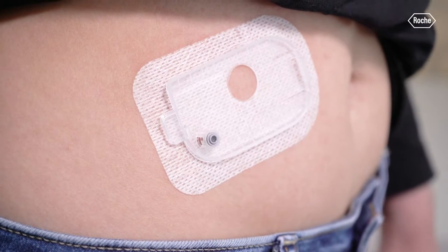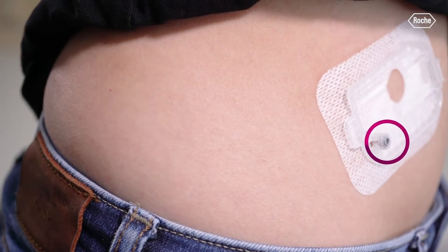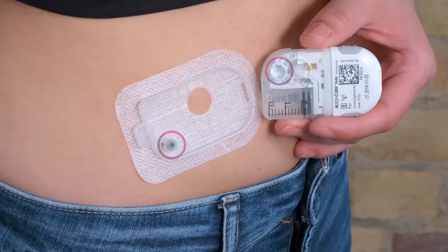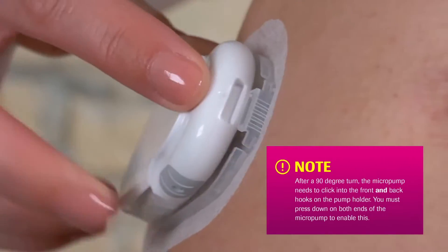The underlay pad, placed down using that applicator, lasts three days — just like Omnipod. The insulin pump can be clipped into it and removed. One reason you'd want to remove it is because this pump isn't officially waterproof like the Omnipod is. The Omnipod can be under 25 feet for up to 60 minutes with an IP28 rating. This one only has an IP22 rating, which really can only survive sprays of water, so you'll want to remove the pod whenever you go swimming or in the shower.